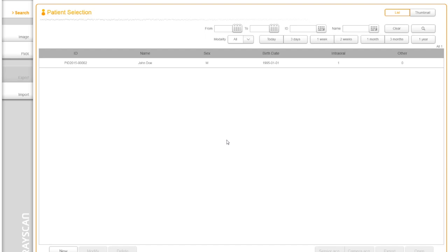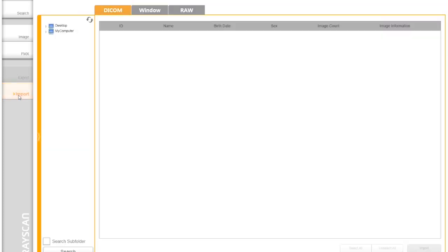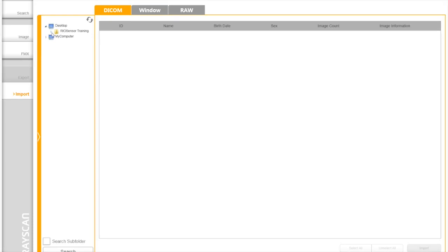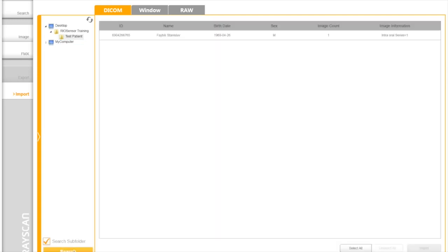There may be times when a dental practice receives images from a source outside of RioView, and they wish to associate these files with an existing patient. Importing those images into RioView will allow them to be stored in the patient's DB record for future viewing. First, click the Import button and navigate to the location of the image. Click on the folder Image exists and mark Search subfolder. Then, click Search button. If you have more than one images to import, use Select All button. To finish the import process, click on the Import button.